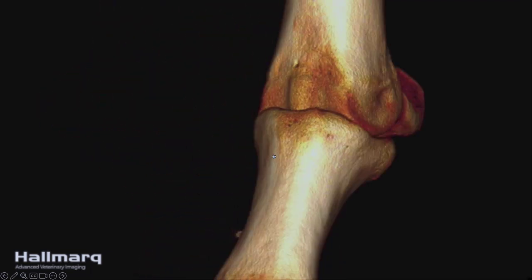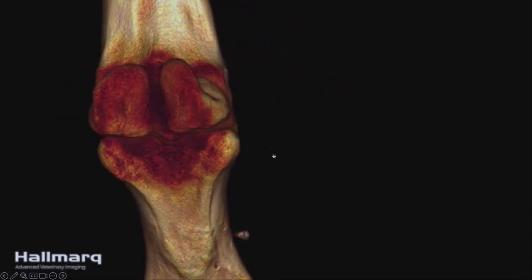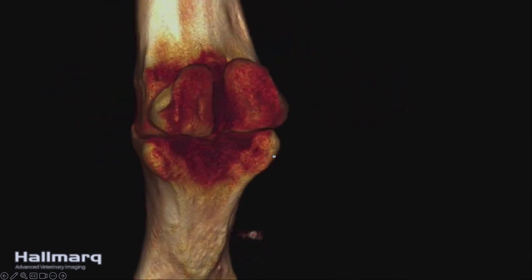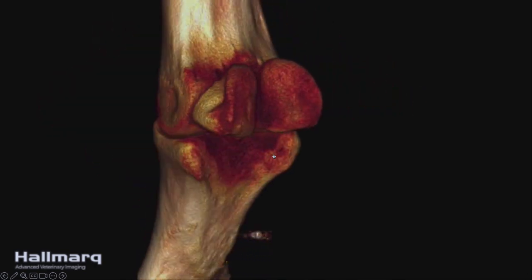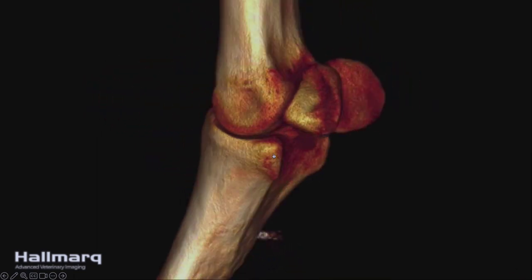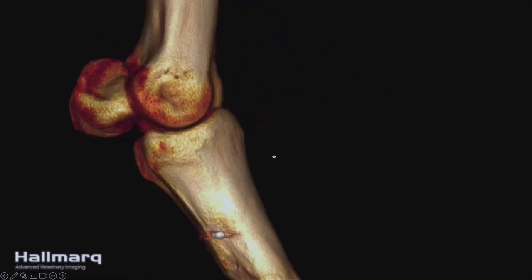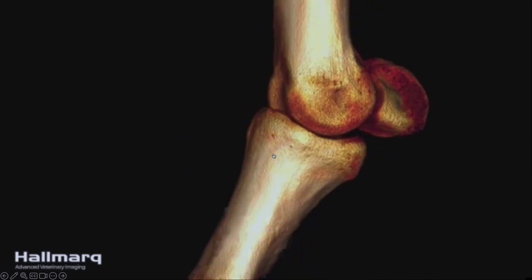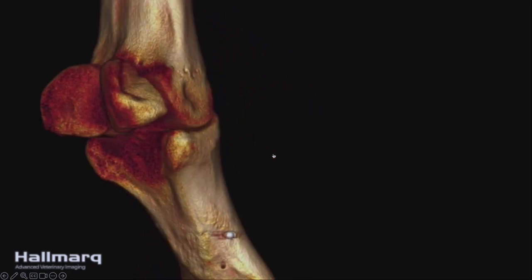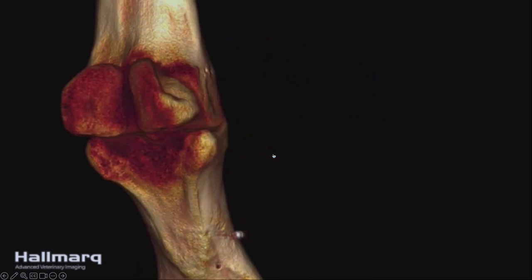It's possible to present, as I mentioned earlier, the surface. Now this is something you can't really do in MRI, because in MRI you don't really have a hard surface. You've got all sorts of different tissue contrasts, but you don't have a hard surface. In CT, this kind of image has a couple of advantages. It's very handy for surgeons in terms of visualizing in 3D space where they might want to put their screws or plates or whatever. But it's also very convenient for showing your client, because this is extremely easy for an untrained human being to understand, where multiple X-rays in multiple different angles might be a little bit more challenging.